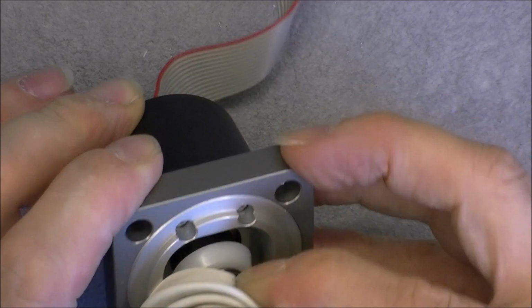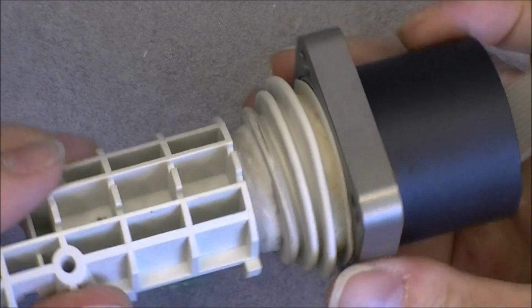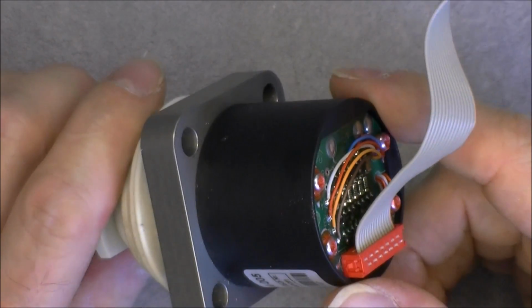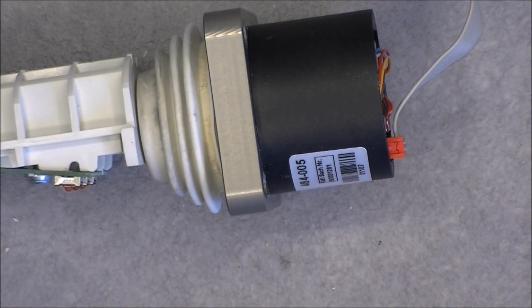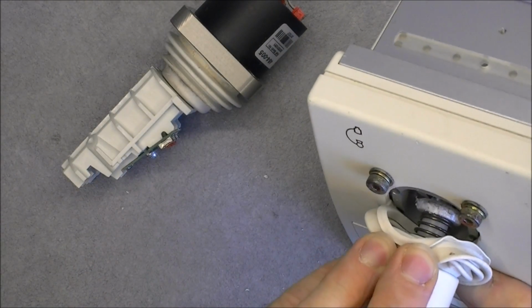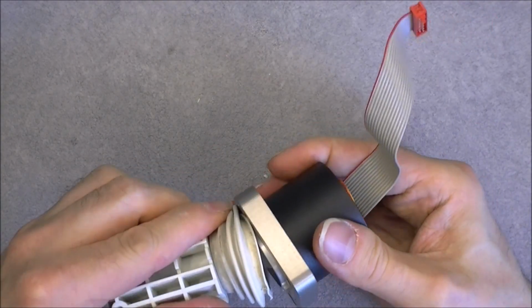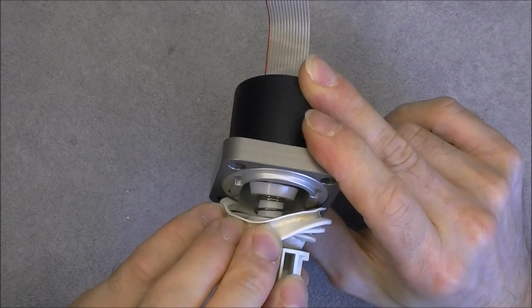Because I am not sure of what will happen if I undo these 4 little screws here. And this one seems to be in good condition. So if I want to take one apart, it will probably be another one in bad condition. I guess it might be this one here, because this one is all dirty inside. There is a lot of dust and such. So I will not tamper with this one for now. It must be a very regular joystick mechanism with just wiper potentiometers.